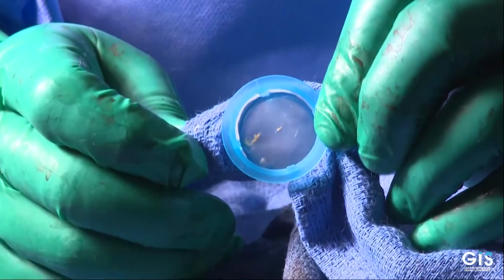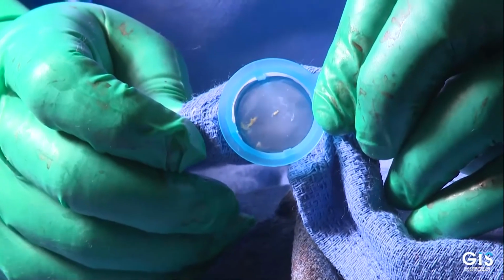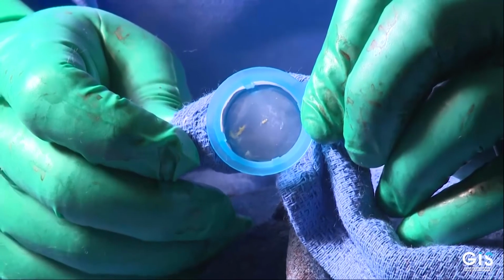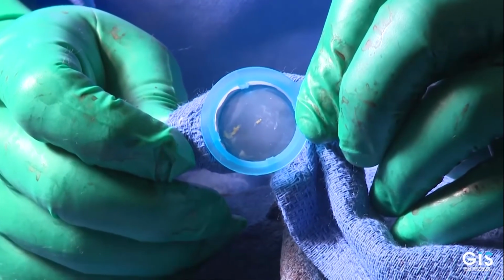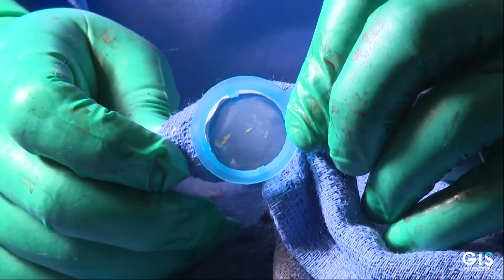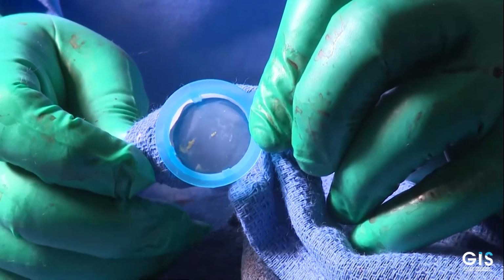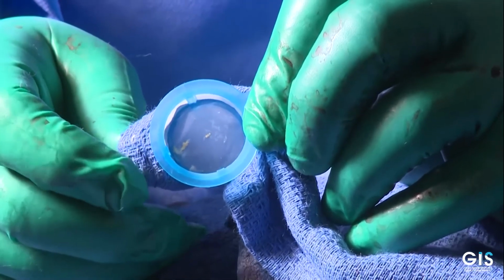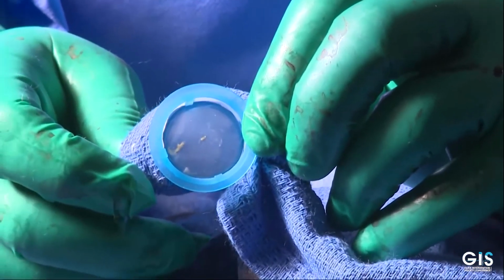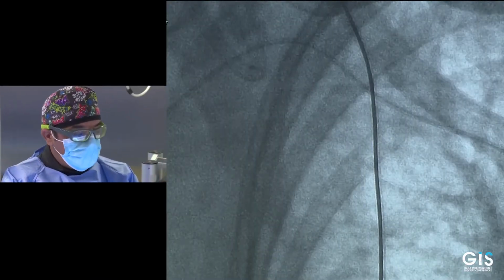So this is an example of the debris that we have collected from the left common carotid in this case. If you zoom enough, you could see the degree of the debris, and those are remnants of calcium likely embolized from the aorta or the valve. How much would this affect the patient is hard to say, but based on trials that have evaluated this, there is a decreased risk of stroke with those patients, and the degree of those emboli to cause a clinically meaningful effect is still under study.